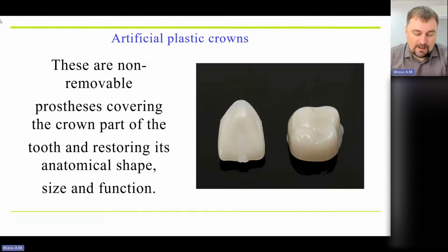And you have to remember, for example, when you're doing soft tissue augmentation around the teeth, to prepare teeth for porcelain crowns or veneers also, and you need to get more gum around the teeth, it's better to use this kind of crown, plastic crowns, and the patient can use it during 1 month, 2 months, 3 months, even 6 months, and it's going to be fine.